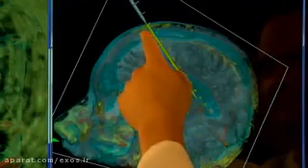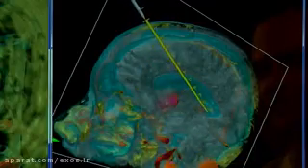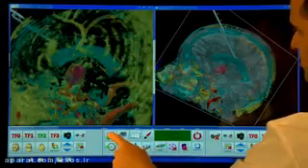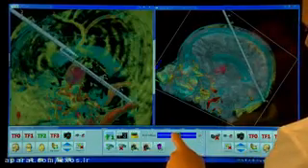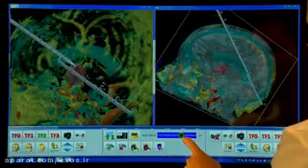For example, if our entry point for biopsy is here, you can see where your needle is going to go, or for placement of your ventriculostomy. We have a sidekick probe for measurement purposes. The sidekick can be positioned and rotated at various angles by scrolling. In addition, we have the ability now to measure how much deeper there is to resect for the tumor, or how far the tumor margin is from this vessel here.